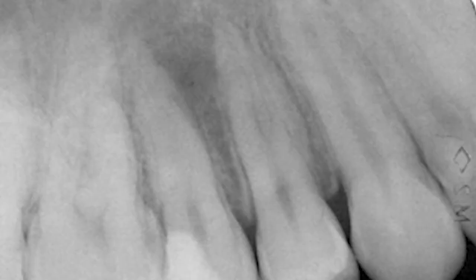Next case is an upper second premolar. On the X-ray you can spot the uncommon anatomy of it and also of the first premolar. The patient came because of pain after a filling that was made a few weeks before. You can see the filling already reaches the pulp floor. It is most likely that this tooth is multi-rooted and you have to search for more than one canal. Also, it most likely has the anatomy of a molar with a palatal and two buccal canals.